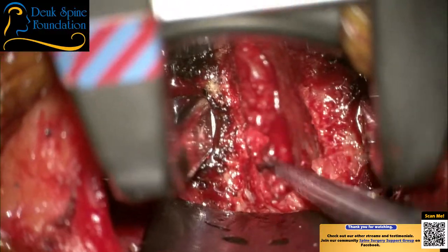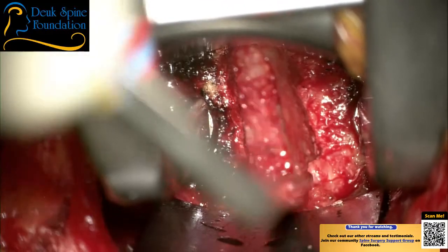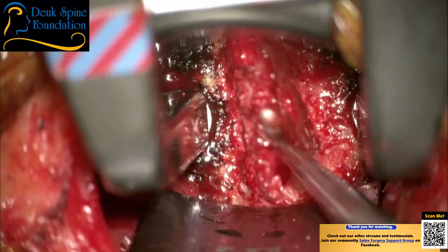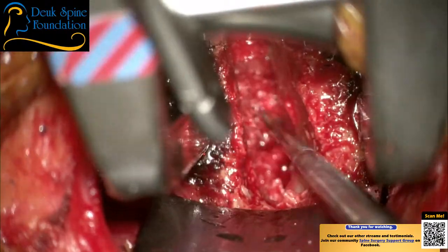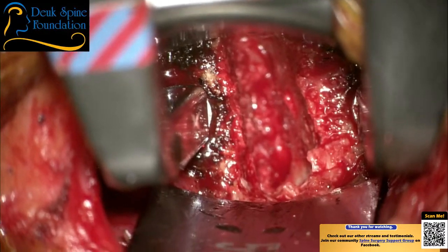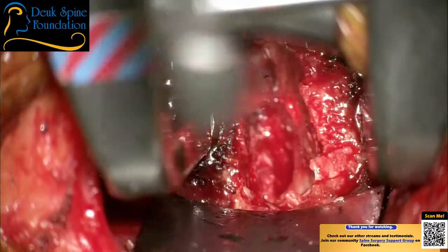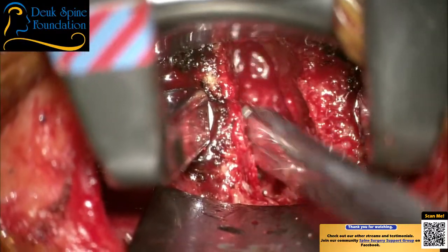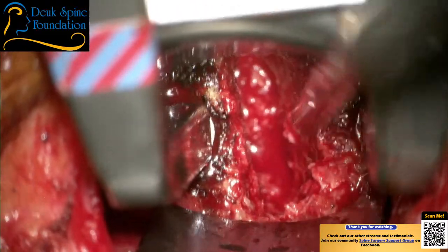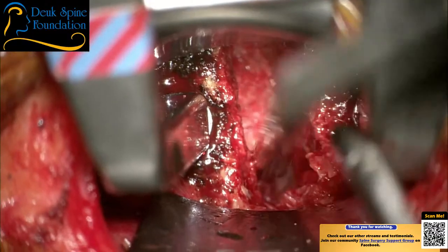Right there's another piece. Okay, there's a piece right there. Get that. Wipe. Grab that stuff, Dr. Patel. Come on. I'm not going to send you a written invitation. And just don't push down. Let me have a pituitary. This angle is kind of bad for you, but you need a sucker and a pituitary. All right, so these are all pieces of the herniation right here. There's still more.